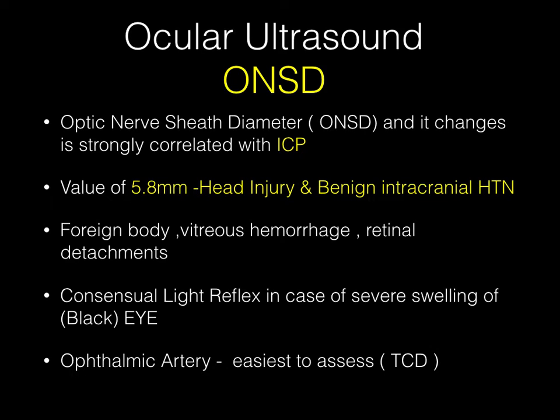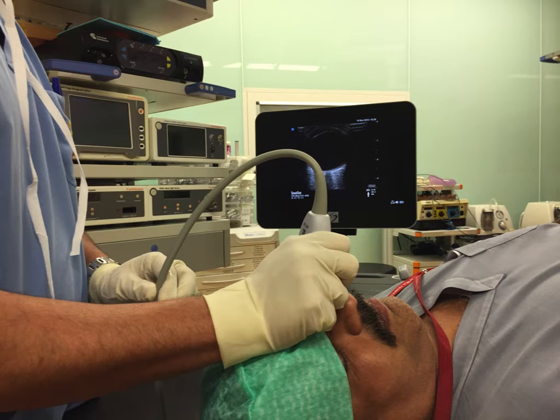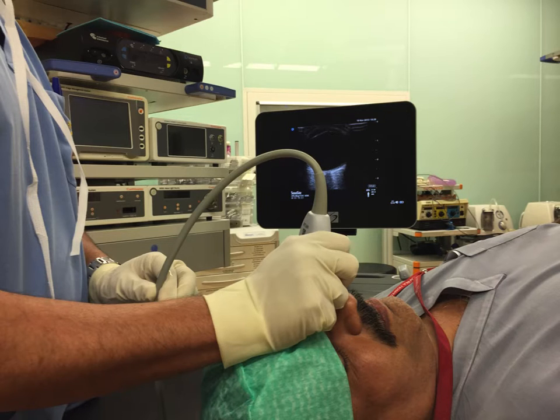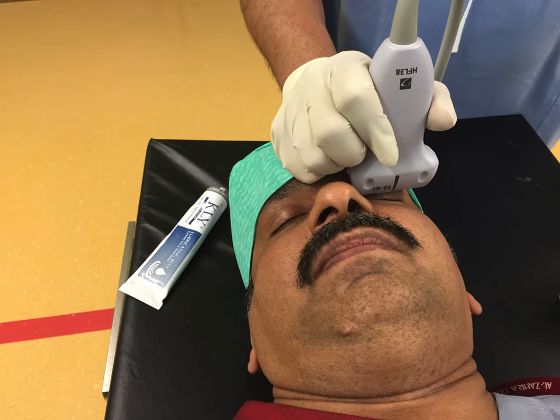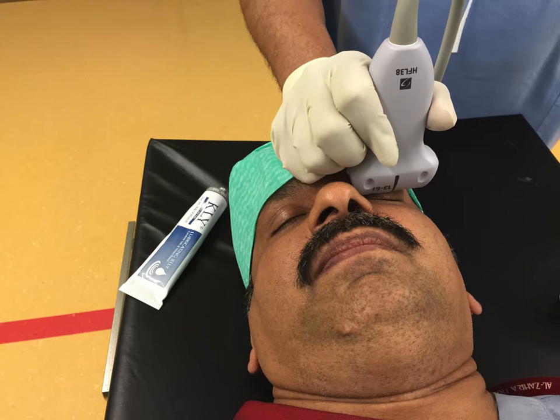Let's go through how to do it — we will discuss all these parameters one by one in future. You put a linear probe, which has a high resolution, over the eye — simply in the midpoint of the eye without applying much pressure. The indicator should be towards the nose, just as a consensus.